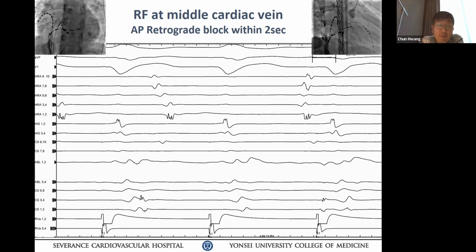cardiac vein 부분에 ablation을 하게 되면 꼭 right coronary angiography 하셔야 돼요. 오케이? 왜냐면 Sunny Jackman 데이터 보면 they published a long time ago, right dominant coronary artery 같은 경우는 PDA가 물론 posterior middle cardiac vein 내려가지만, there's a posterolateral branch cross through the middle cardiac vein. They had a patient who had a myocardial infarction on the table. That's one of my patients, unfortunately.